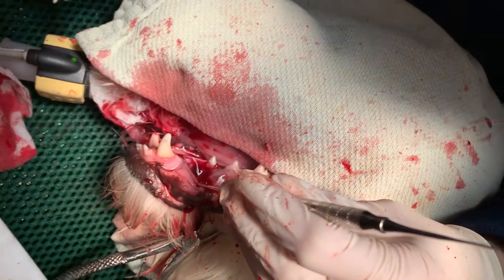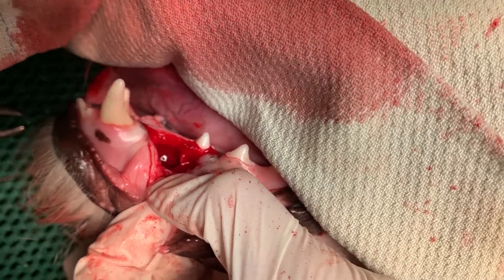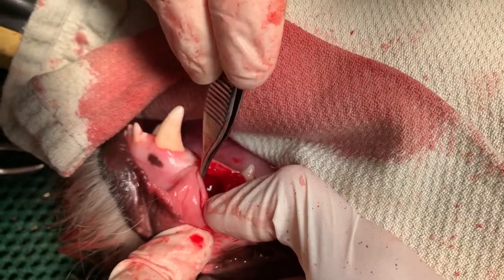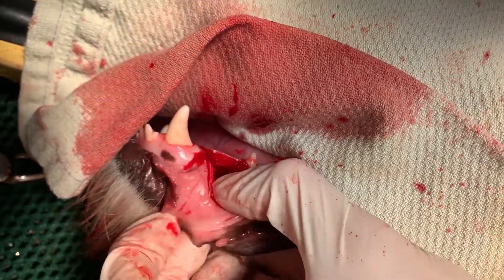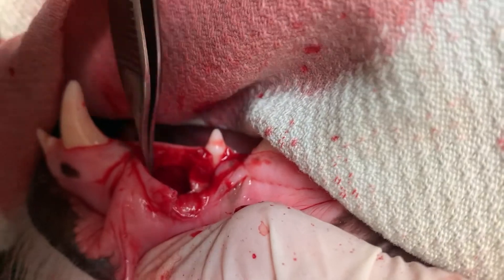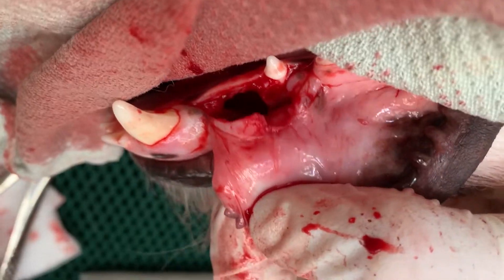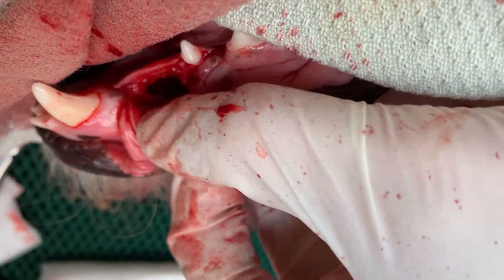You can see there's quite a large hole going down from where that cyst was. Once it's all cleaned out, we will bring the gingiva up. That diamond head drill bit is one of my favorite tools to help smooth down the bone. It helps debride the tissue we don't want in there and is quite gentle with the surrounding gingiva, so it's definitely a must-have for any veterinarian doing dental work. You can actually see a little bit of how the neck of the canine tooth is exposed. Now we'll bring that gingiva back up — we have plenty of play — and get it closed.